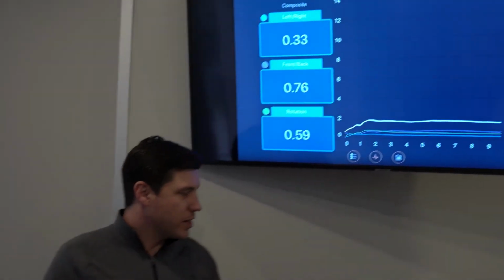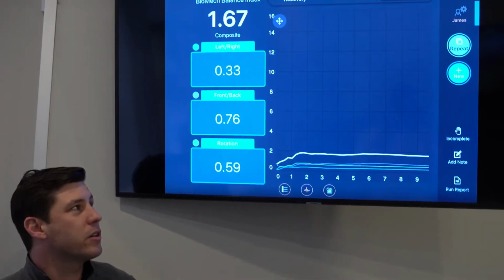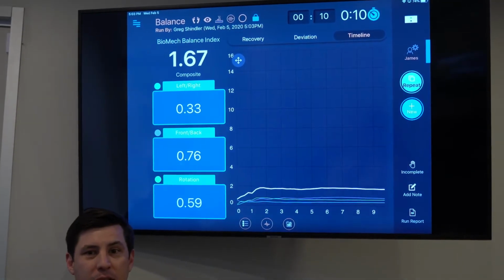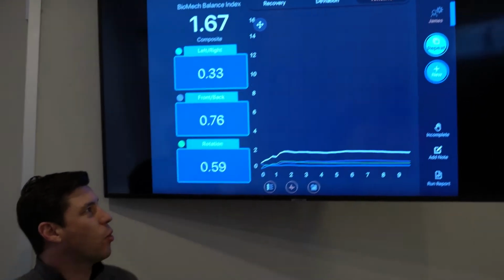Great. So here it gives us some quantifiable data that we can compare in the future. So if James had neuropathy that was significantly affecting his balance, it would be very obvious here. And what's important about this is if you're off balance, or if you are not engaging one side of the body or the other, you get these compensatory changes that perhaps you only had one problem a year ago, but a year or two down the road, now you have another problem because the other side has been compensating for it. So this is a really valuable tool that helps guide treatment, and it also helps us measure outcome.